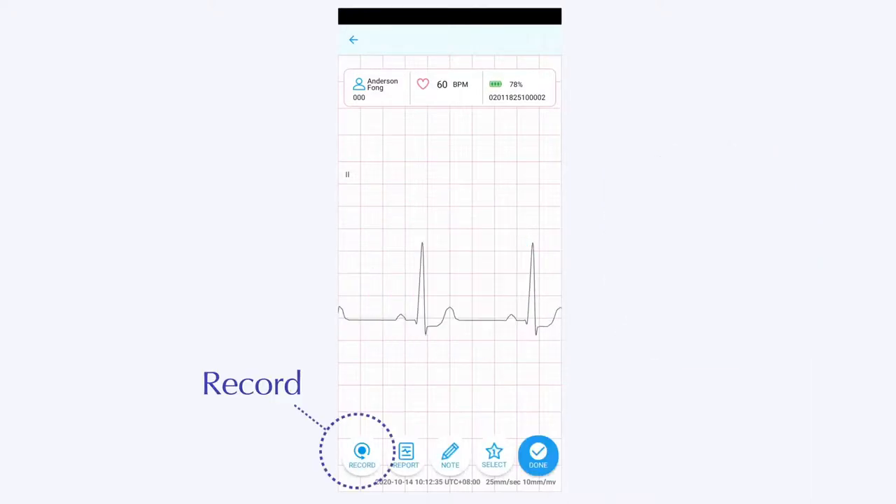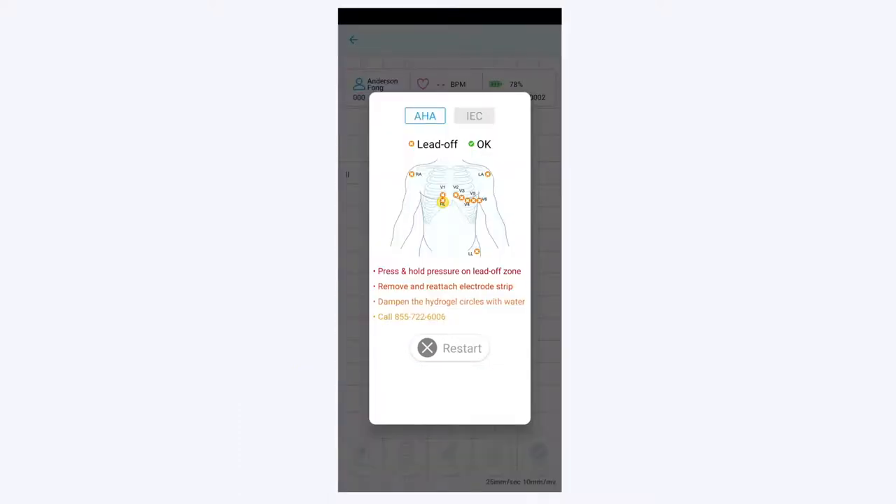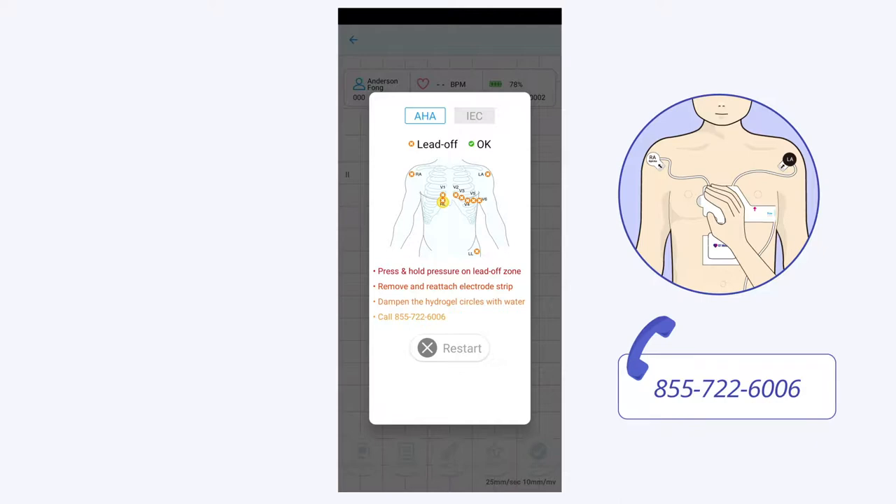Please press the record button and record two more ECGs. If you see an error screen, please go through the troubleshooting steps: press and hold the electrode in the indicated areas, reattach the electrode, or call customer service support.